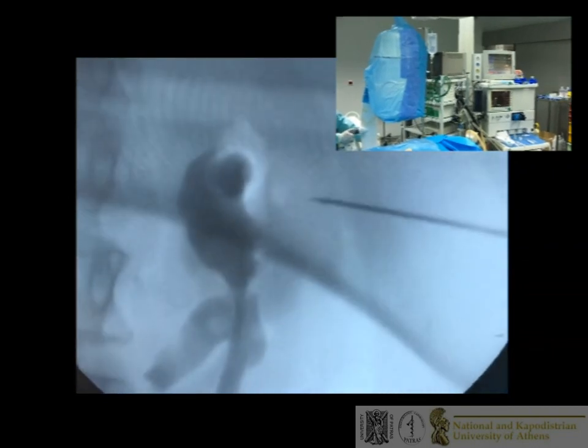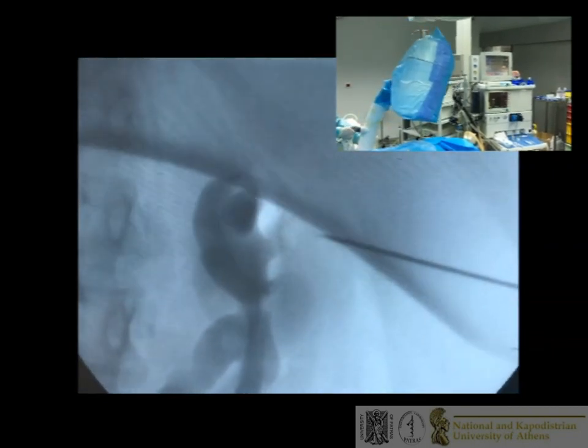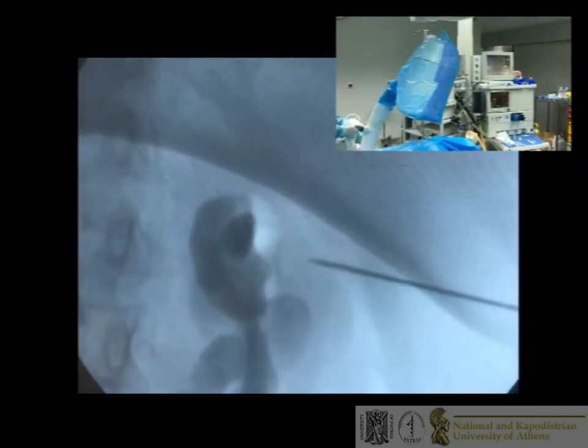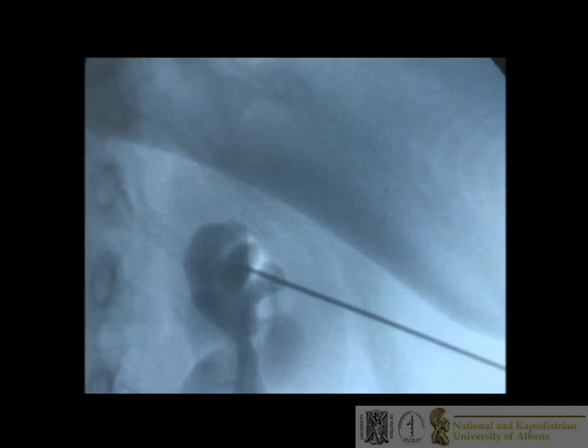In clinical practice, to avoid unnecessary kidney punctures, the surgeon can assess the depth of puncture before entering the kidney by performing the same maneuver with the needle a few centimeters away from the final target.